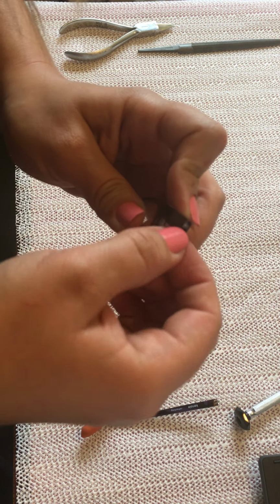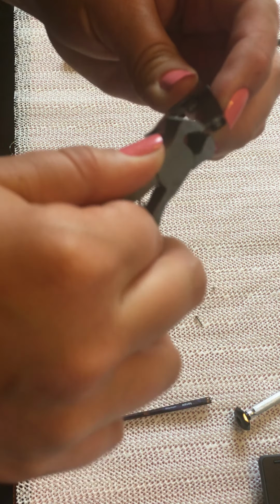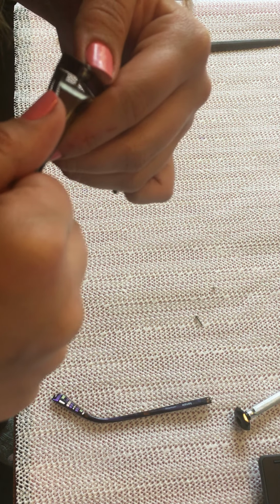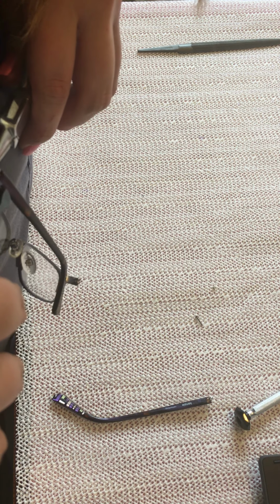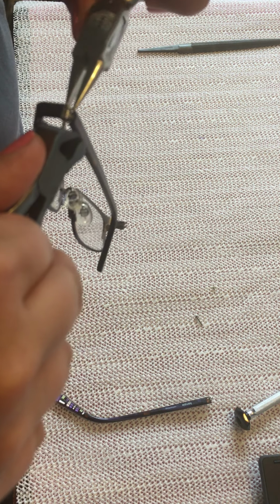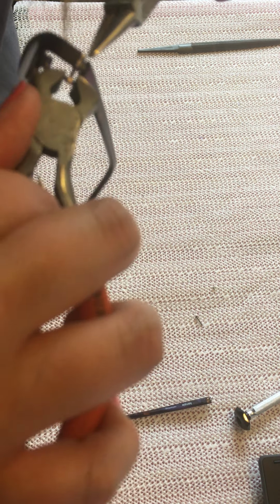I guess my movement makes it come out. Okay, so I'm gonna try to, maybe if I hold it with my needle pliers, maybe if I hold it in place, then I just turn it.